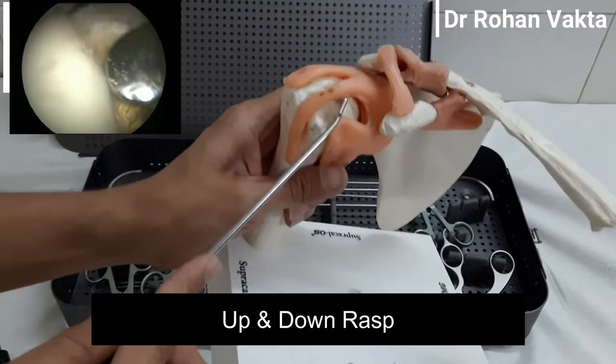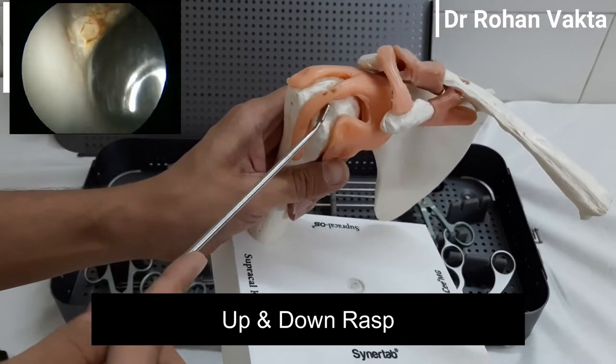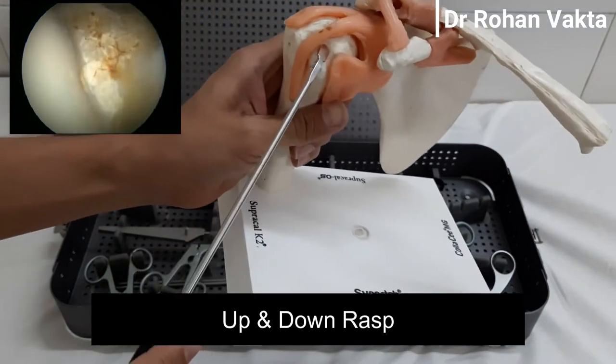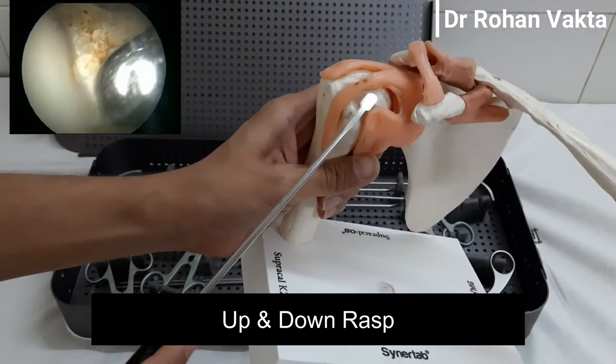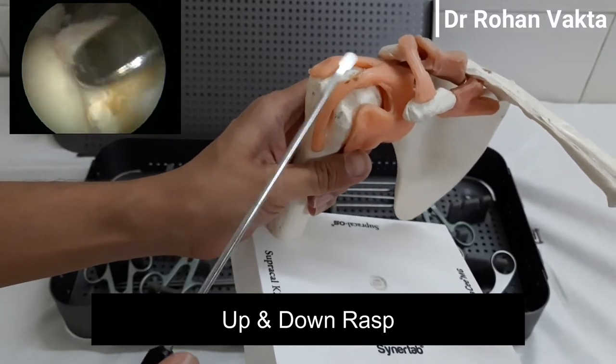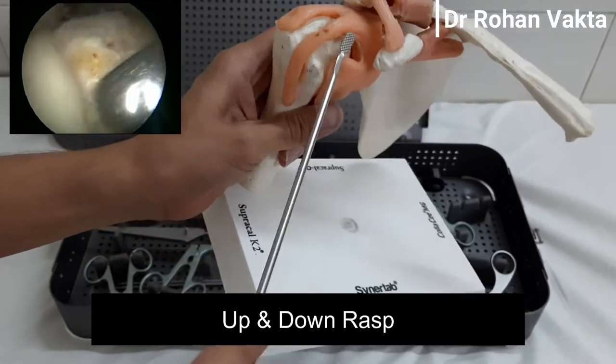While doing rotator cuff repair, the rasp is used to create a bleeding bed over the footprint area. While doing Bankart repair, it is used on the medial surface of the glenoid for better healing of the glenoid labrum. It can also be used to remove a spur from the undersurface of the acromion.